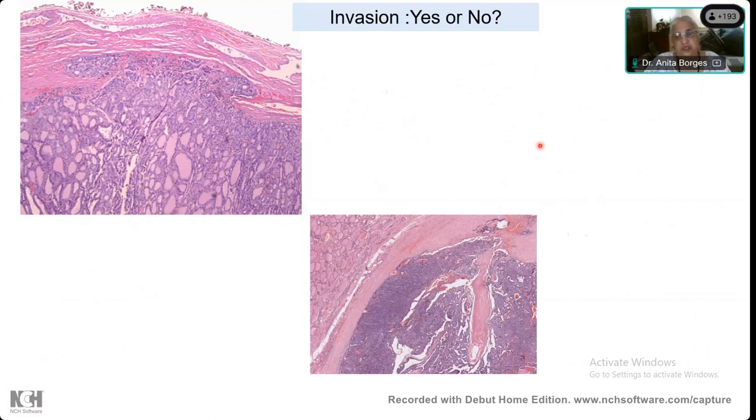Well, it most certainly is invasion. This is another capsule that has formed outside. You can see this is the capsule. It has broken through, and a capsule has formed. So this is the capsule of the lesion, and you see it as a tongue or a tuberculum that is over there, and outside that another capsule has formed. So this is invasive. Apart from anything else, look at this tumor. This tumor is so solid. But this is invasion of the capsule.